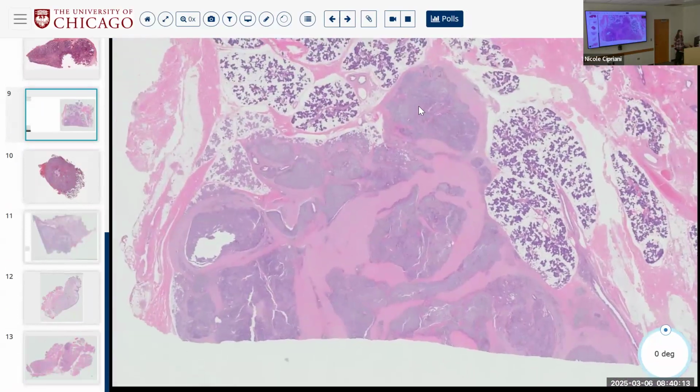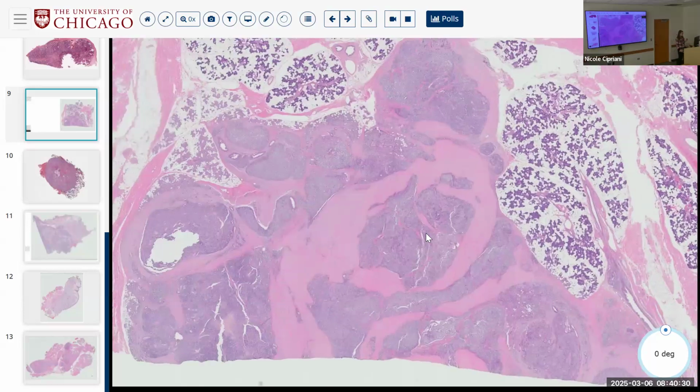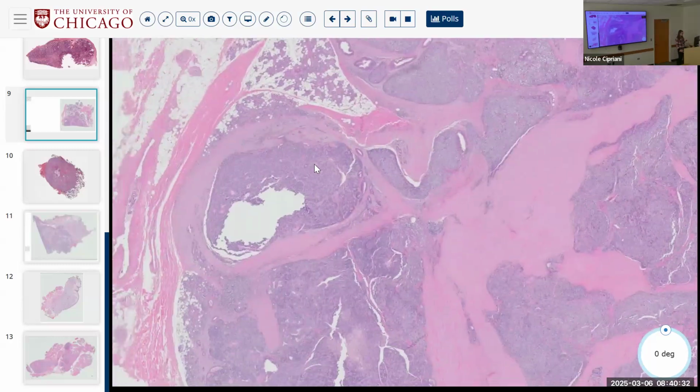All right, malignant or benign? Malignant, excellent, right? Salivary carcinoma with infiltrative lobulated growth, malignant, right? So circumscription doesn't always mean benign, because circumscribed can be malignant, as we saw in the acinic cell, but infiltrative is always malignant.